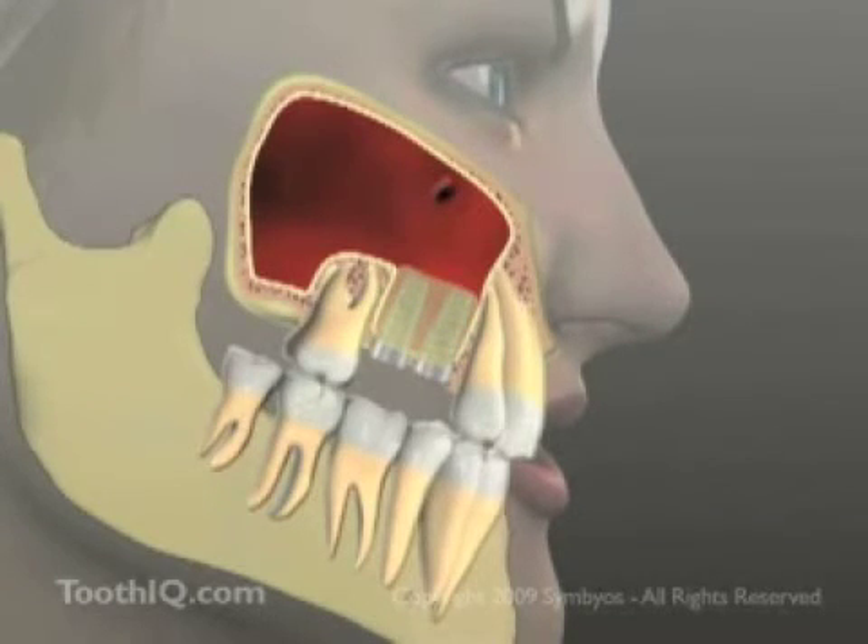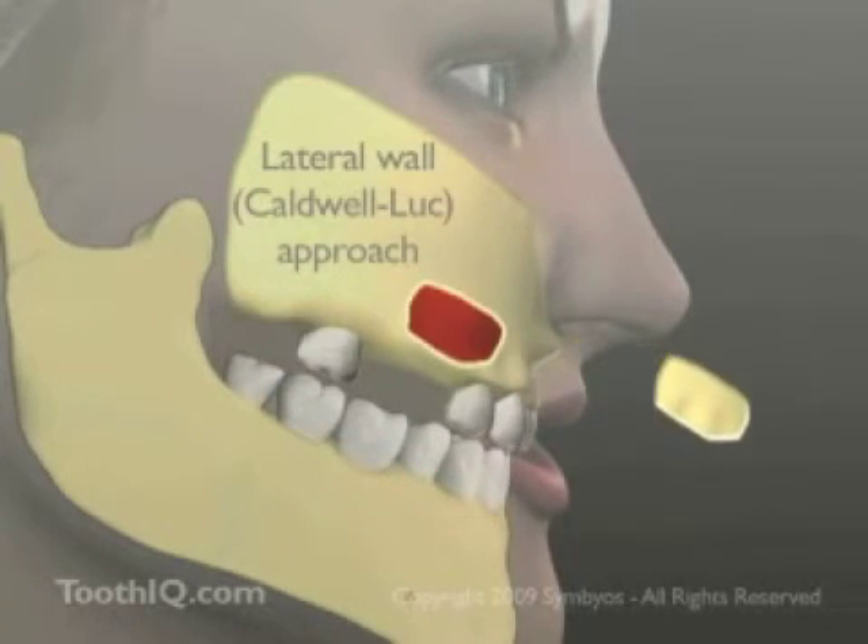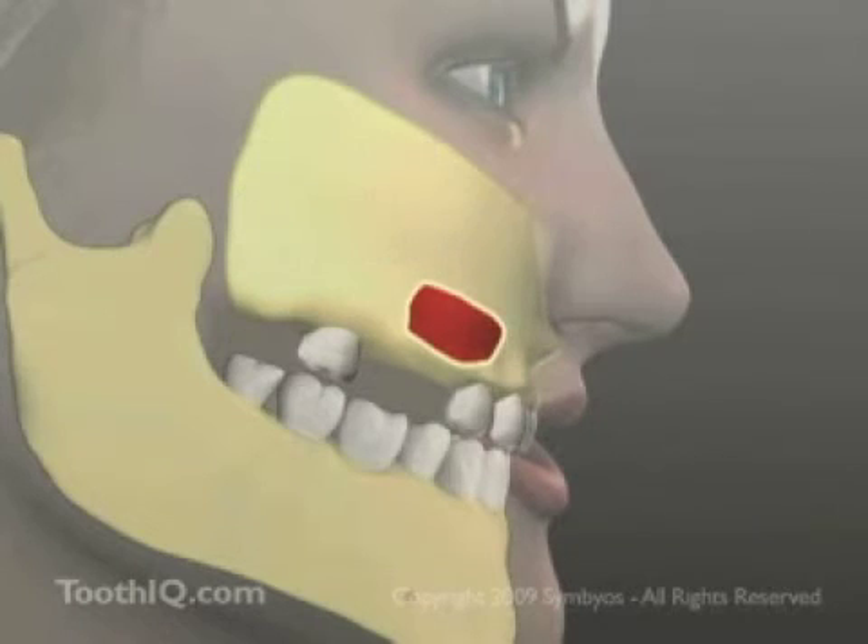There are two common methods for elevating the floor of the sinus. In the lateral wall approach, a soft tissue flap is raised and a small, oval-shaped piece of bone is removed to gain access to the sinus.